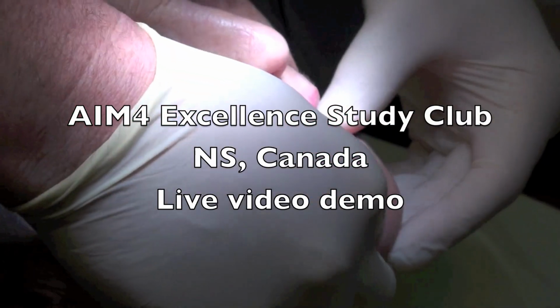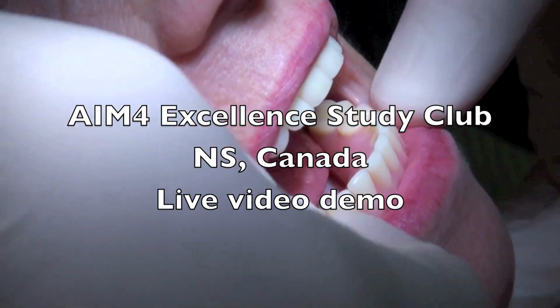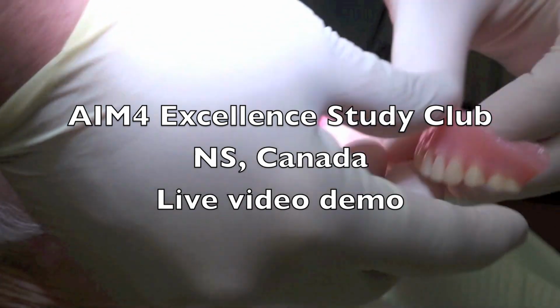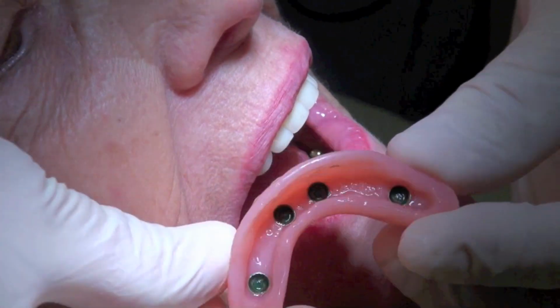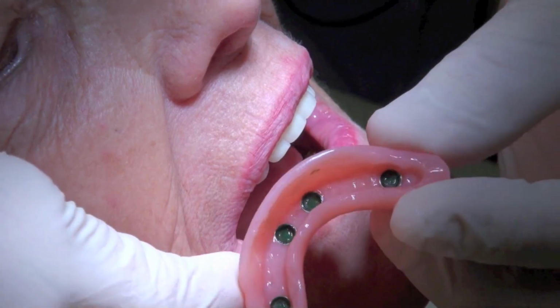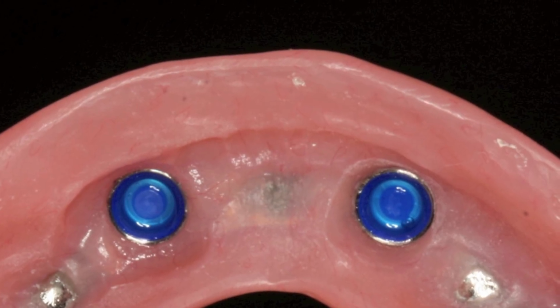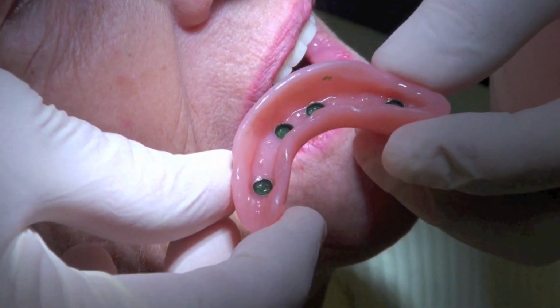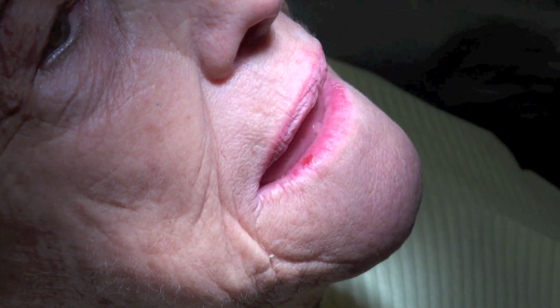But this is starting to lift off a little bit too easy. So it still serves her, but this should be clipping down. And you can see that the attachments were blue, and now they've turned green, which is quite often the way that it happens. So they've turned a different color. So we're going to get those out, and we'll do that first.